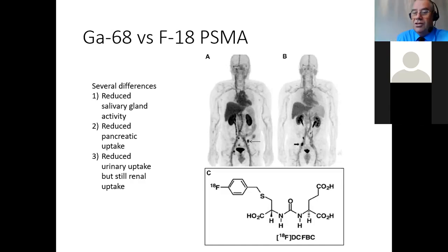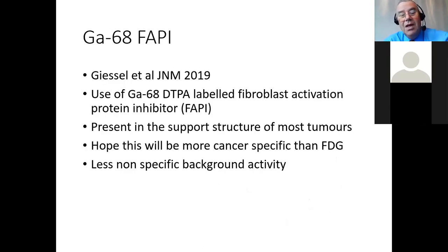The big advantage of the fluorinated PSMA is you don't need a gallium generator. So if you can get hold of FDG, there's the probability you can get hold of fluorinated PSMA. Not now, but in the future. So the last thing we're going to look at is Fappy.